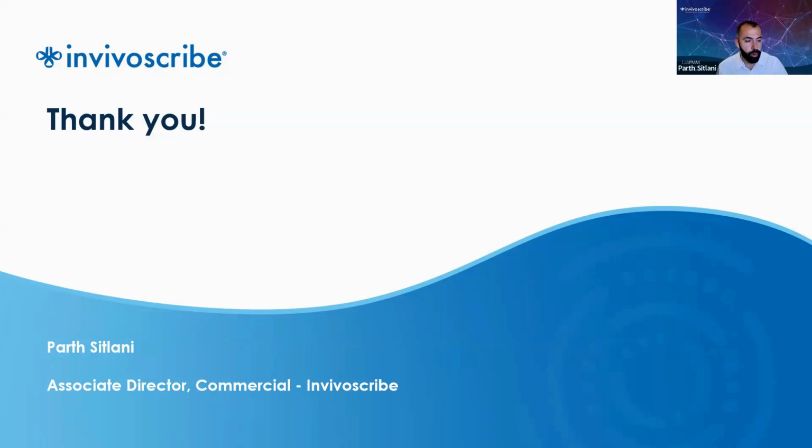Yes, thank you for that question. It's a good question. The results you mentioned that show the detection across the different platforms are for baseline clonality detection, or you can call it screening for that baseline sample. For MRD testing, we know that you need 4.4 million reads per result. So not just the cost from the assay, but even the cost from sequencing would become very high. We recommend you only pick one target, the target that was positive for screening.